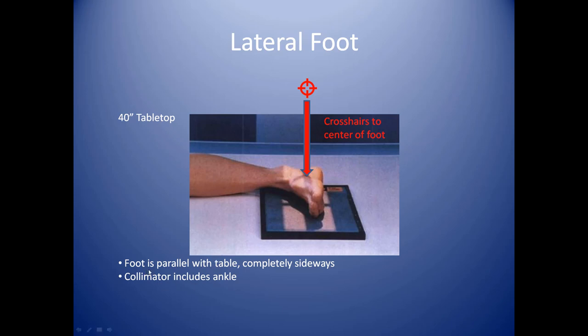The foot is parallel to the table — it's completely sideways. It's not too hard to eyeball, but you do have to pay attention. Make sure that it's not rotated. Also, make sure you're not cutting your toes off on the edge of the cassette. This is close — you may want to rotate your cassette diagonally so you're fitting the entire foot on the cassette.